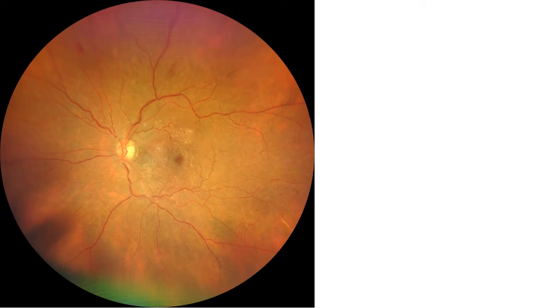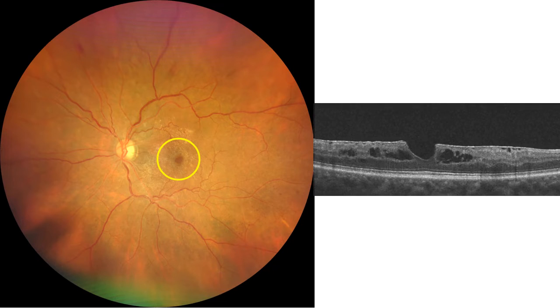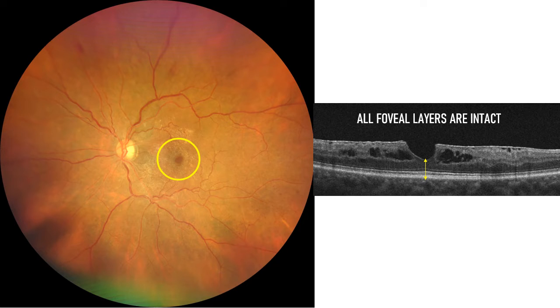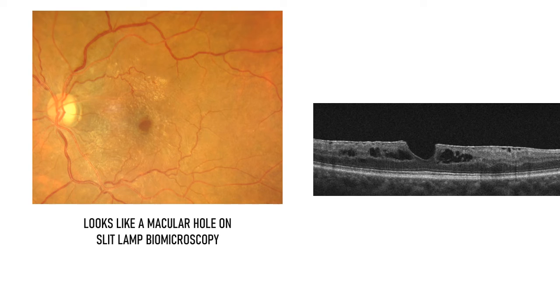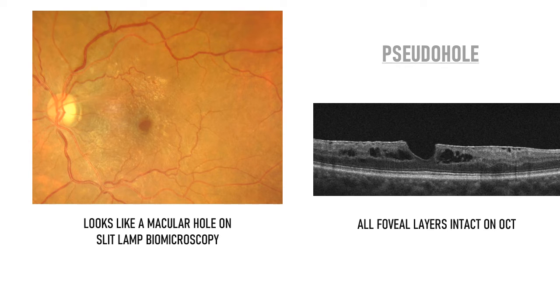Now let's see another fundus photo. This is again the left eye of another patient. Here again you can see a circular reddish area in the center. Let's see what the OCT looks like. In the OCT, you can see that all the layers of the retina at the fovea are intact — there is no defect. So this appearance of the macula on clinical examination, usually on slit lamp biomicroscopy, where it looks like a macular hole but on OCT the retinal layers are found to be intact, is known as a pseudo hole, because it might appear like a macular hole but that is a false appearance.